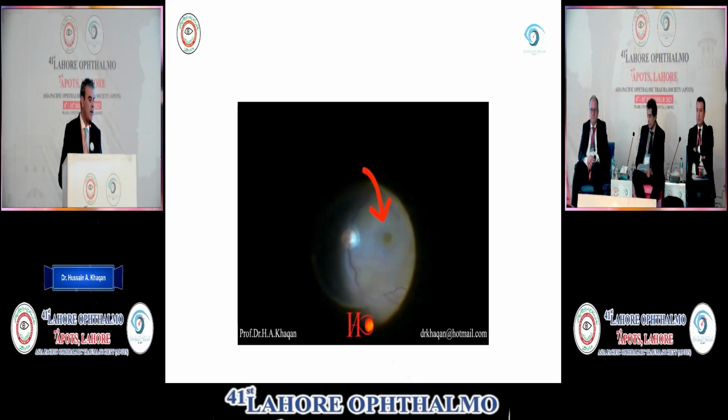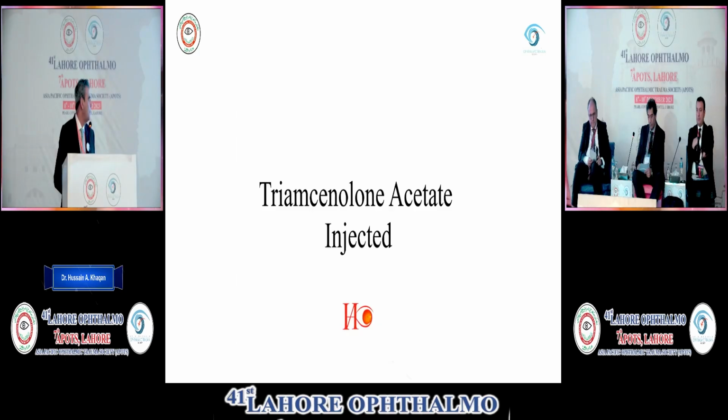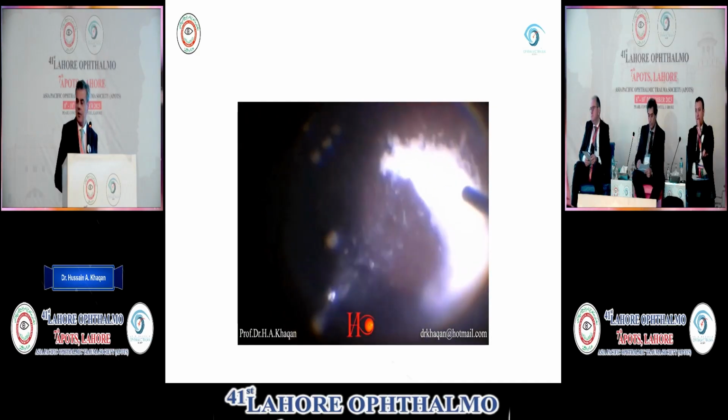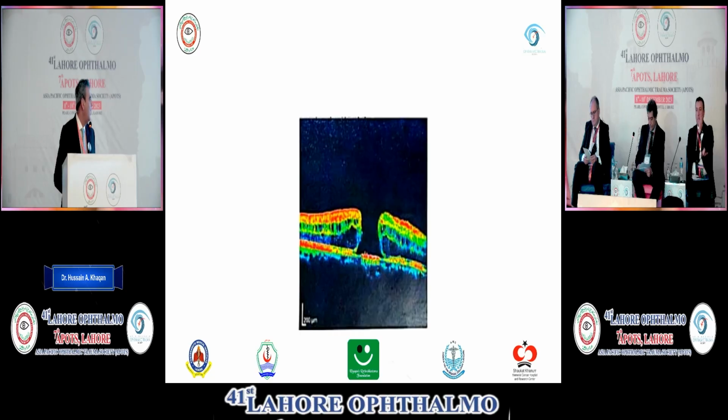This is another case. I think it's repeating the same one. That one is not playing. Okay, anyhow. This was the macular hole size in this patient, about 900 micrometers.